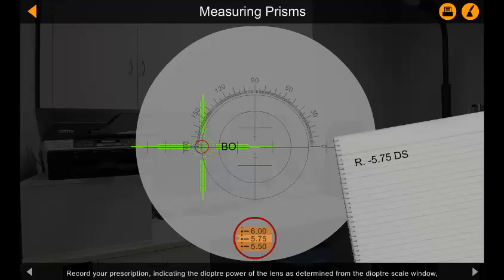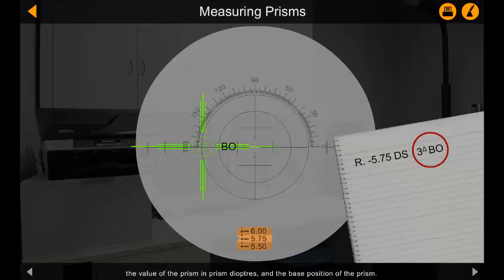Record your prescription indicating the diopter power of the lens as determined from the diopter scale window, the value of the prism in prism diopters, and the base position of the prism.